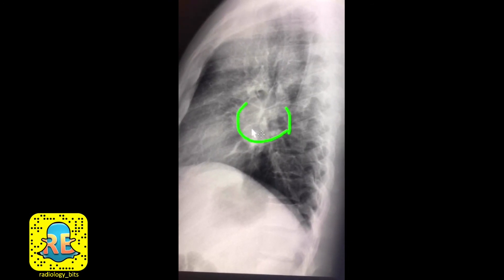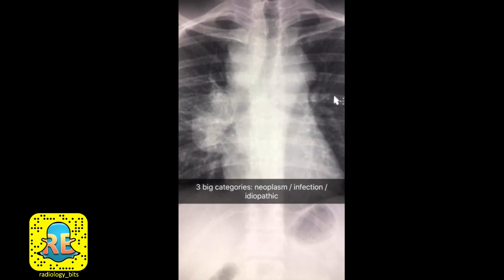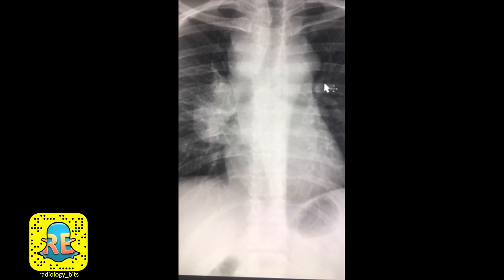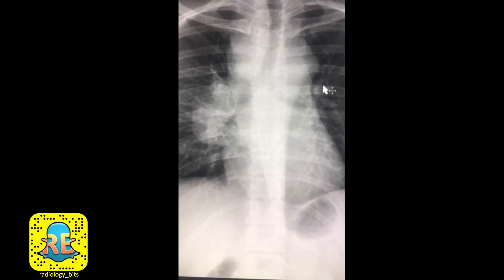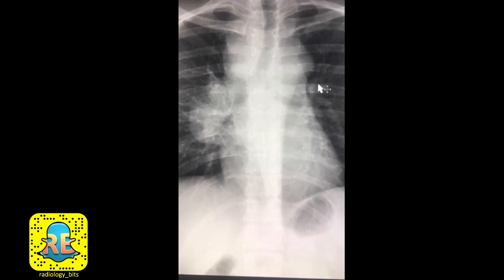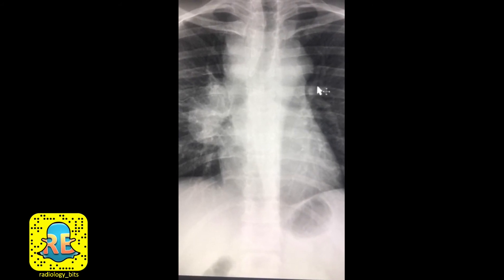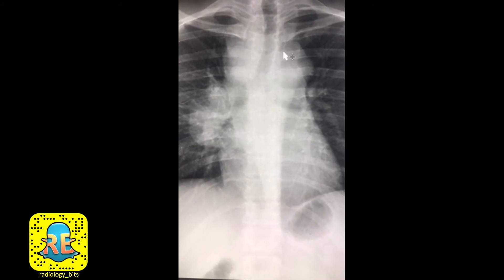Whenever you see what seems to be an abnormality surrounding the hilar area, this is also a sign favoring lymphadenopathy. Suspecting intrathoracic lymphadenopathy, the differential diagnosis falls under three categories: neoplasms — including metastasis and lymphoma; infection — including tuberculosis, fungal infection, and others; and idiopathic causes — where sarcoidosis is a main consideration.